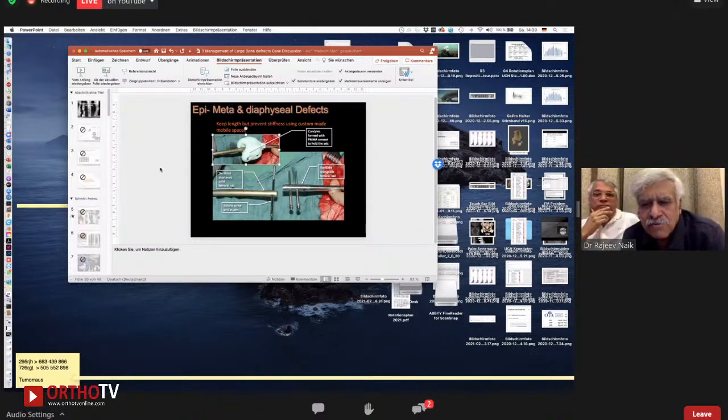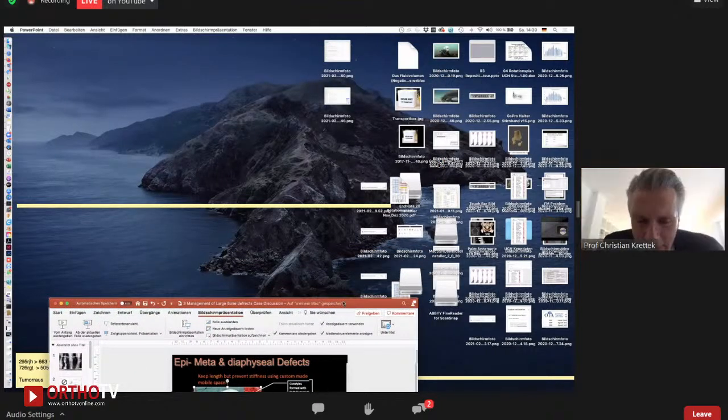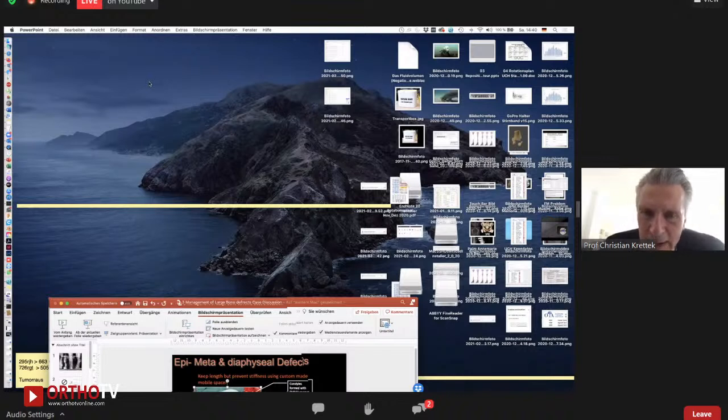The one question is, how can we compare the lesser trochanter of the other side when we are putting the leg on the leg holder? Yeah, good question. This needs to be done before the operation. You start the operation with checking the lesser trochanter shapes of the healthy side and store it in the image intensifier, and best is to print it out. Second, then you check the hyperextension range of the contralateral side in order to have it when you need it. So third is you store the Blumensaat line position in the image intensifier and print it out. So you have full control of these parameters, but once you have put it somewhere or try to assess it intraoperatively, it's getting difficult.